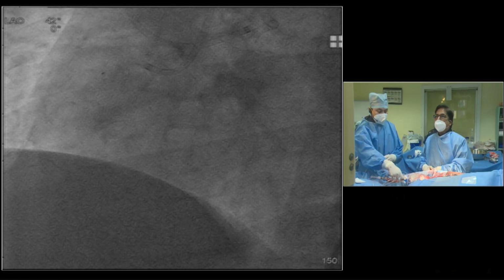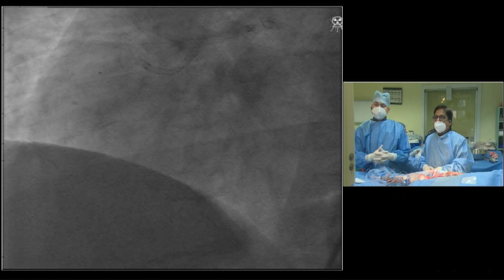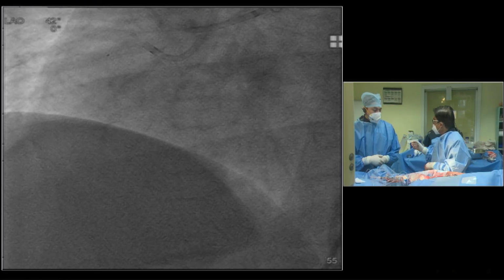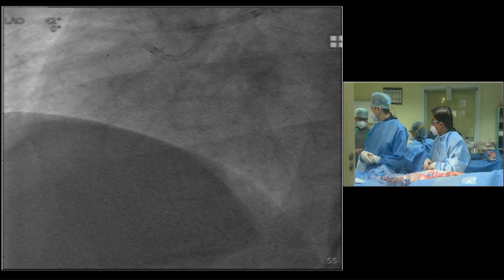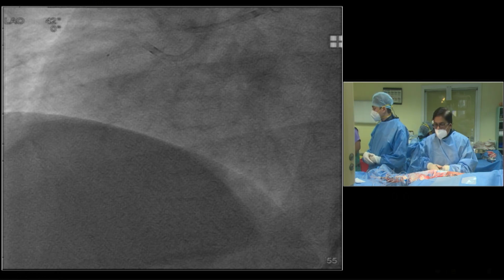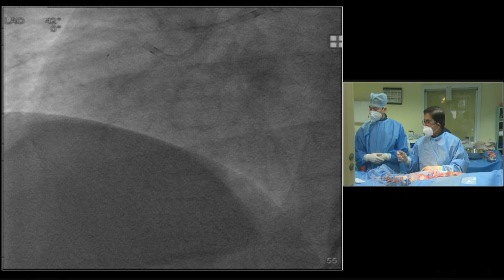So the wire choices, he started with the XTA, but he was not getting through, so he tried XTR. Now he is going with the Gaia First. After Gaia First, he will go to the next step, which is the escalation technique.